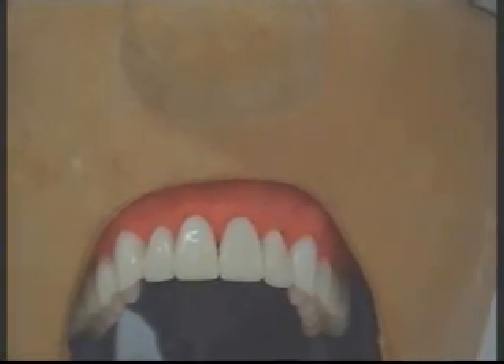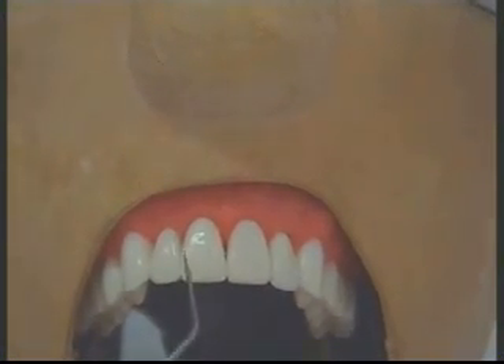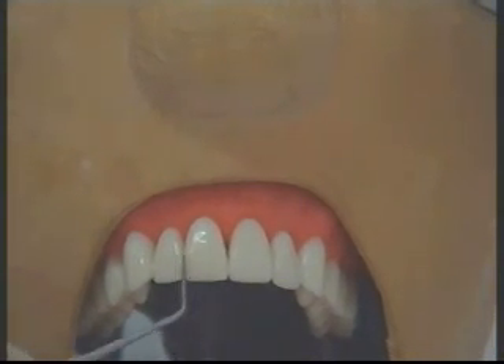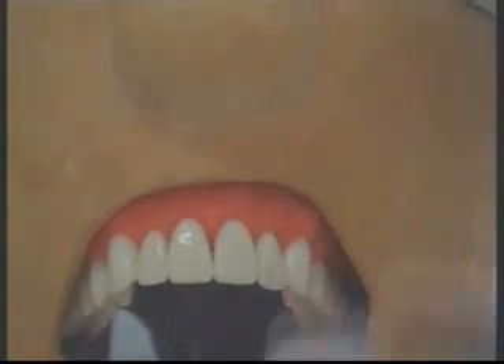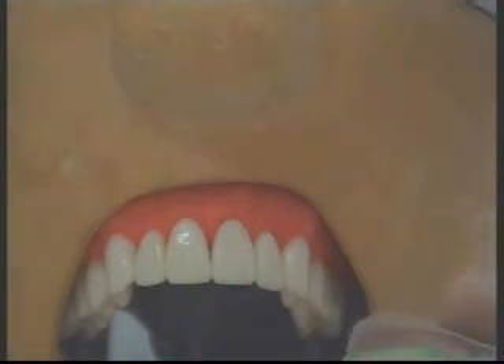We are going for a demonstration of the tooth preparation for an all-ceramic restoration or a metal-ceramic restoration in case of tooth 1.1. If the tooth is not having any surface defects, as it is here, we have the steps that we are going to do. First thing we are going to do is to prepare a putty index using this silicone material, and this is the activator. Mix the two things together.